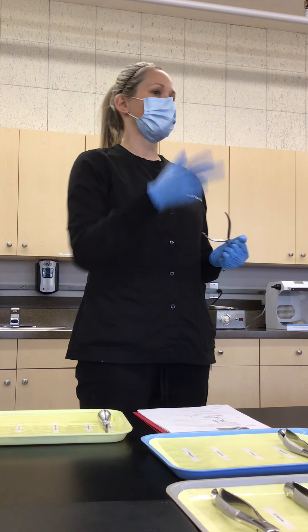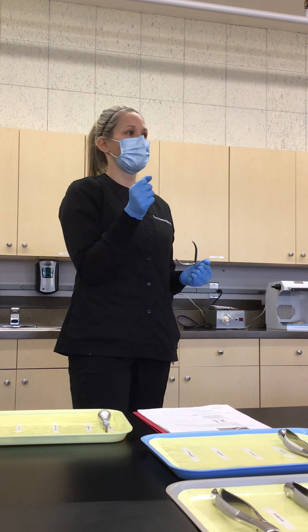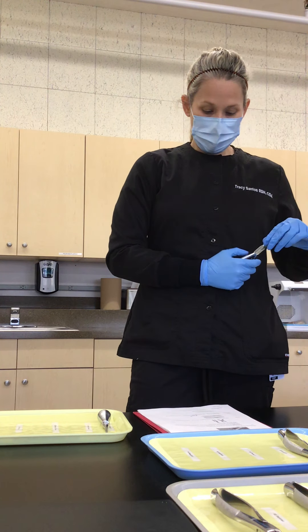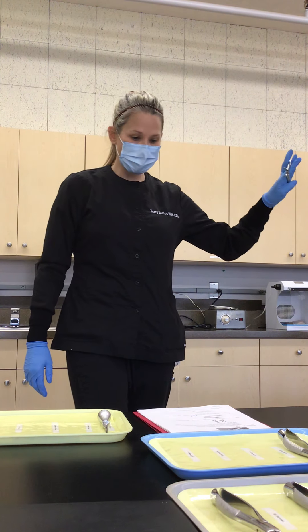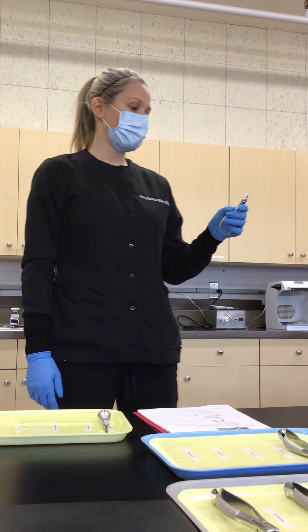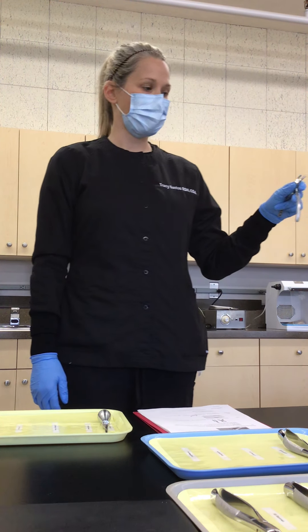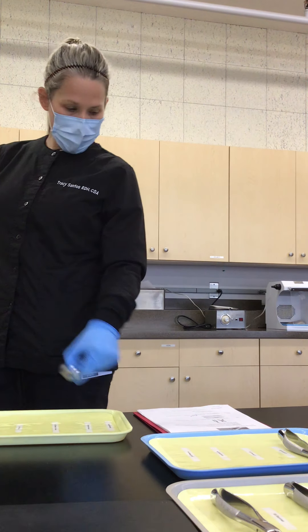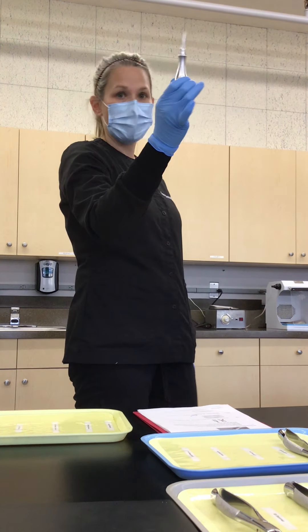For a simple extraction in a general office, besides your elevators, they might just start with a 150 and a 151, with a couple things to the side for problems. With the universals, they can usually take the teeth out — we're loosening them up with everything else first. They rock buccal and lingual to ultimately get the tooth out. Right under the 151S is the rongeur, which reduces or removes alveolar bone if they need to do any contouring — it's side-cutting. There's also the pediatric rongeur.